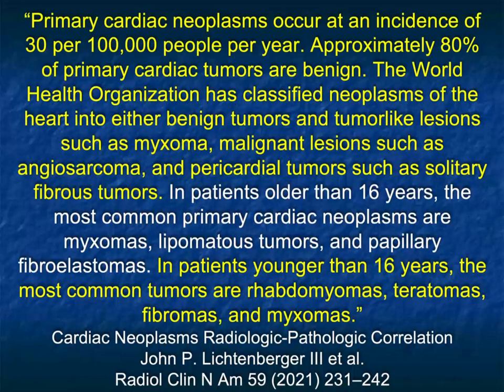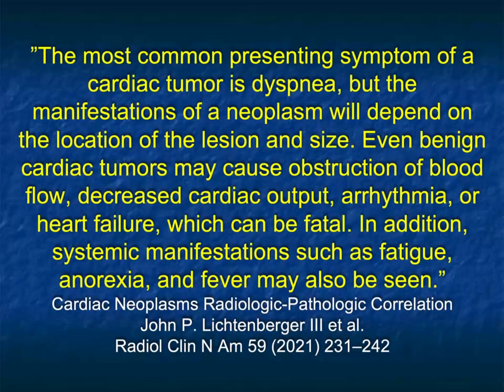In patients older than 16, the most common primary cardiac tumors are myxomas, lipomatous tumors, and papillary fibroelastomas, while in patients under 16, so we'll consider the pediatric population, the most common things are rhabdomyomas, teratomas, fibromas, and myxomas.